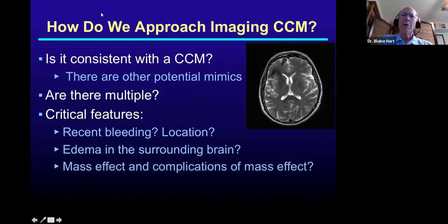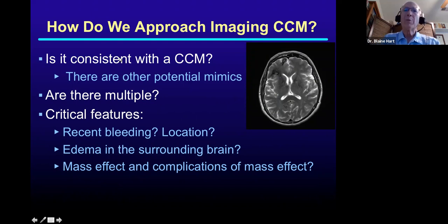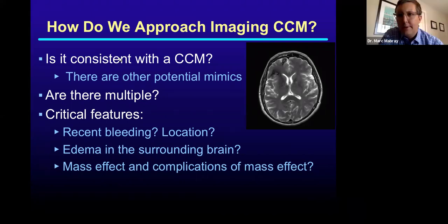Usually that would be referring to the black areas around the outside. And the chronic part of it is? Well, that represents hemosiderin, which is the late form, and it gets deposited and laid down in the brain, and it can stay maybe throughout the person's life. Kind of seeing the end stage of breakdown products with iron type signal, creating that dark appearance.